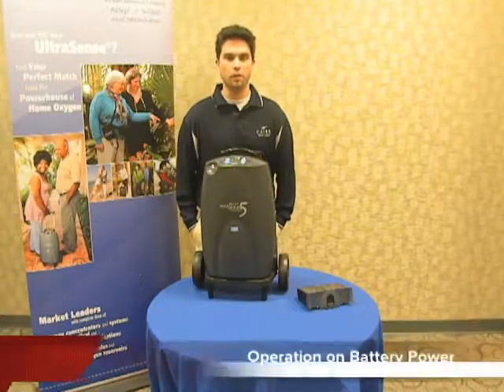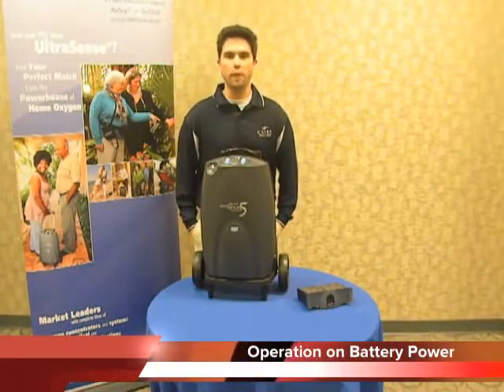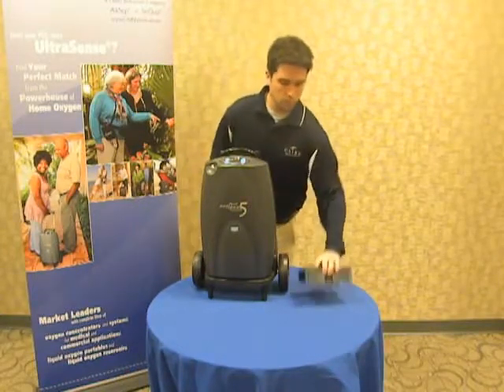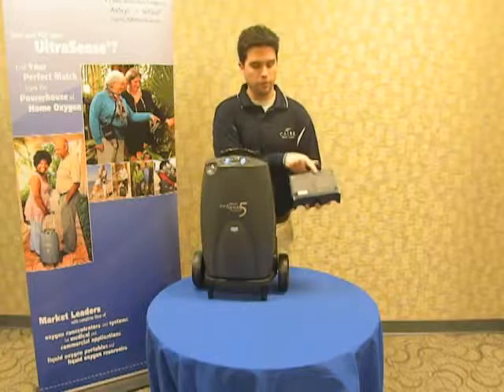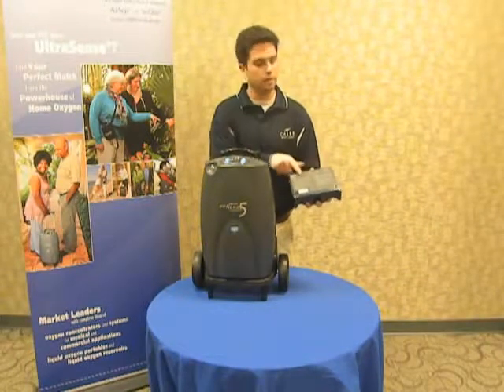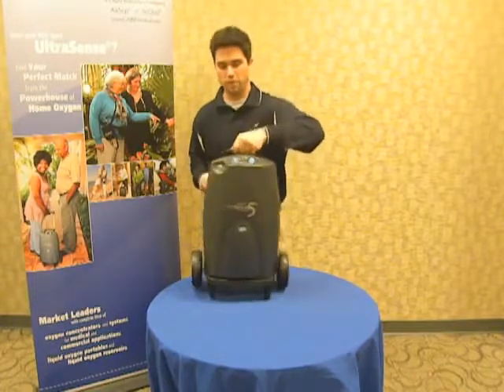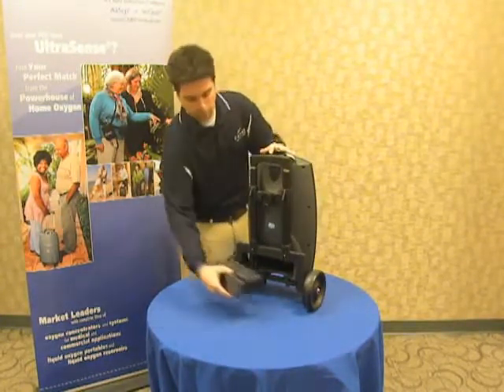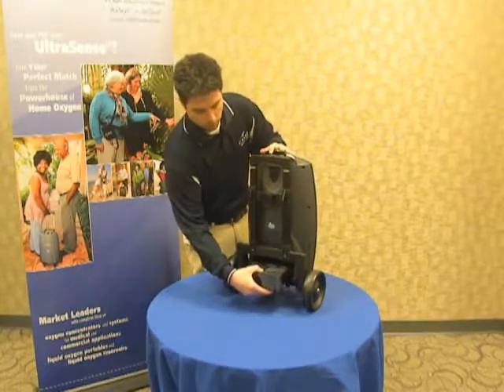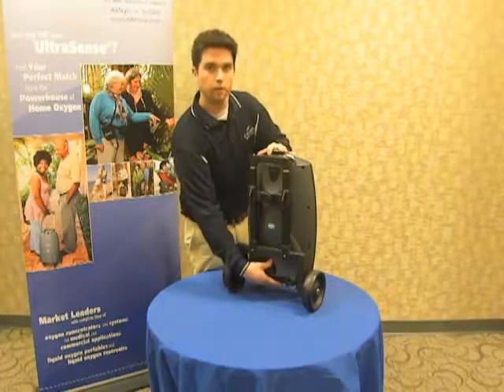Now that the Eclipse is on the cart, we can install the battery cartridge in the back of the unit so that you're ready to run on battery power. Your battery cartridge does have a top and bottom. Note that there is text on one side. This is what we consider the top of the unit. To insert the battery into the back of the unit, simply align the battery up straight and insert it into the hole. Be careful not to use force and to install very gently until you hear it click.